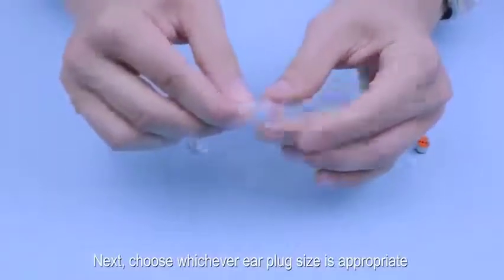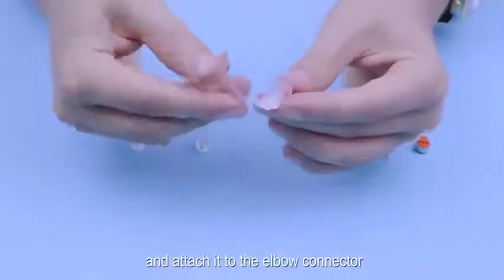Next, choose whichever earplug size is appropriate and attach it to the elbow connector.